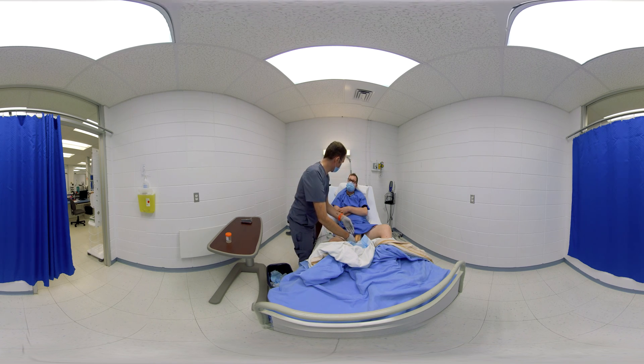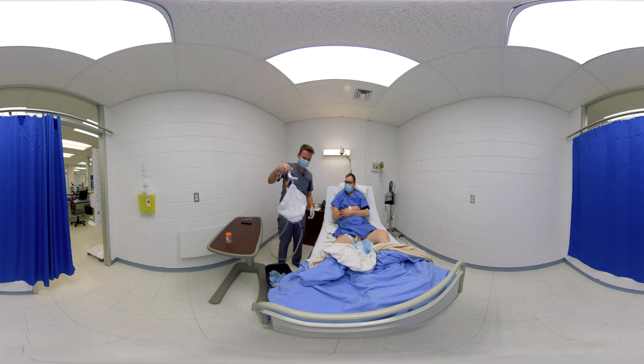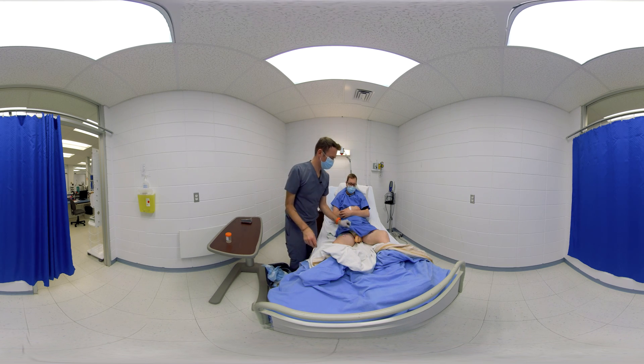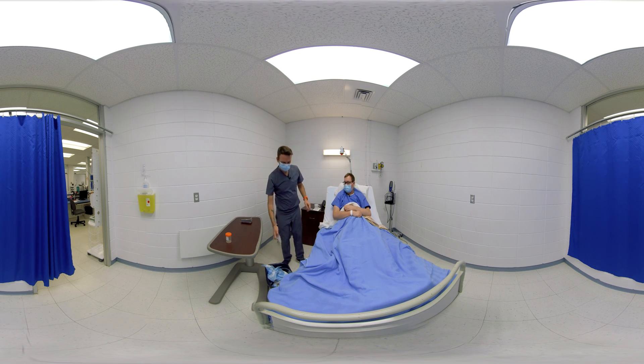Okay, I'm ready to remove the catheter. Please do like if you're trying to urinate. The nurse asks the user to push as if trying to urinate to relax the external sphincter and facilitate removal of the catheter. The nurse also pinches the catheter between thumb and finger to prevent any urine from leaking out. The nurse examines the urinary catheter for damage after removal to make sure the entire catheter has been removed. The nurse places the waste bag in a biomedical waste bag to prevent the spread of pathogens.